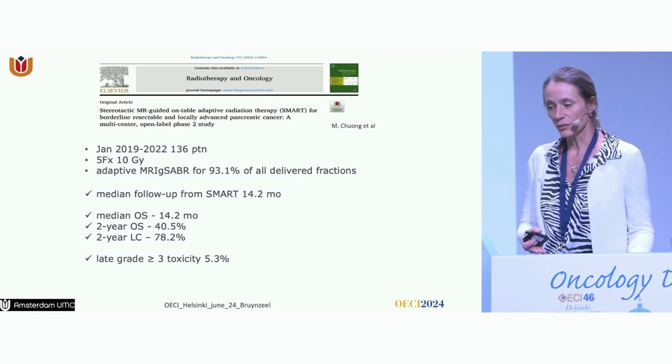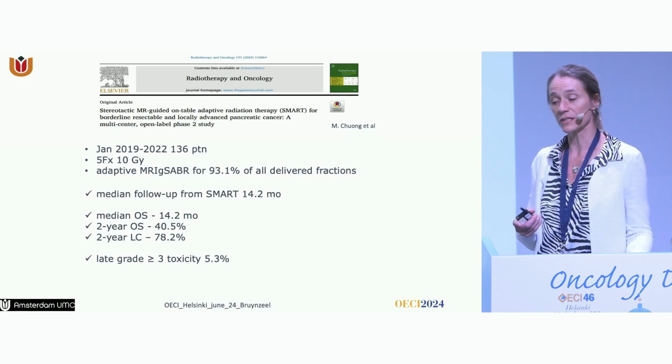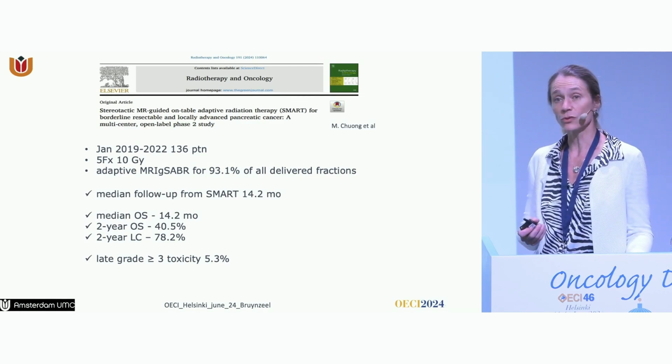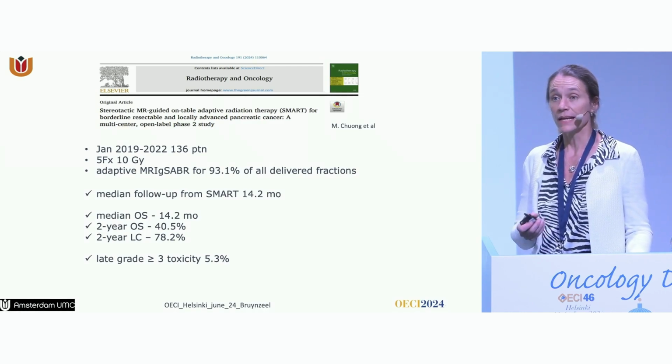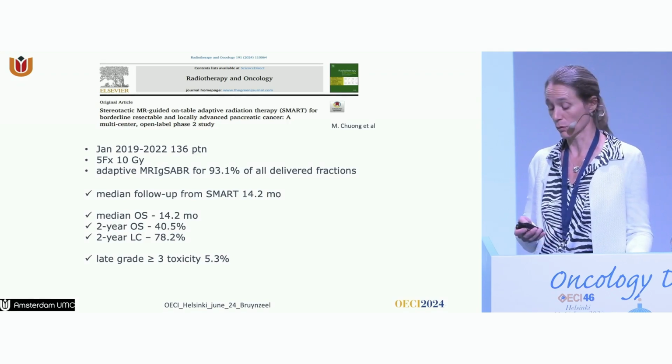Regarding the effectiveness of MR-guided radiotherapy, the more mature results of this study showed a high local control at 2 years of almost 80%, and again, a low rate of late grade 3 or higher toxicity.